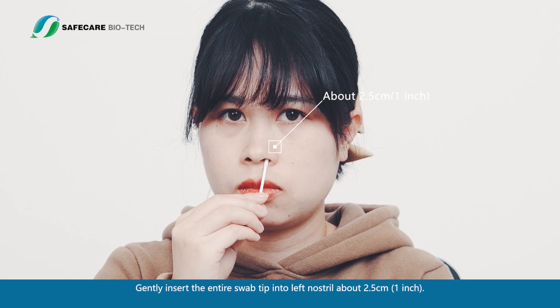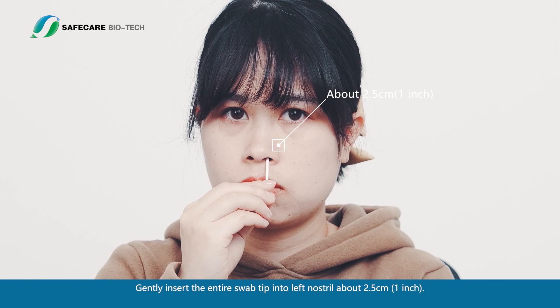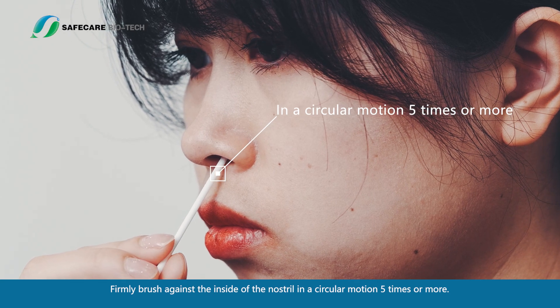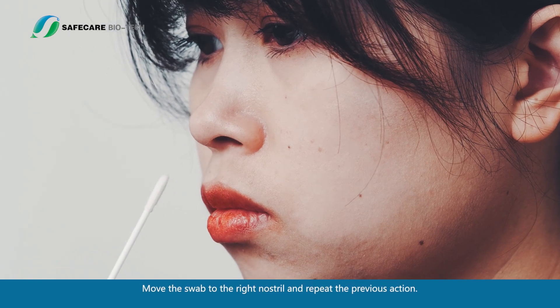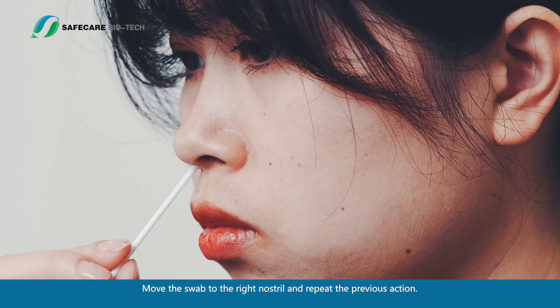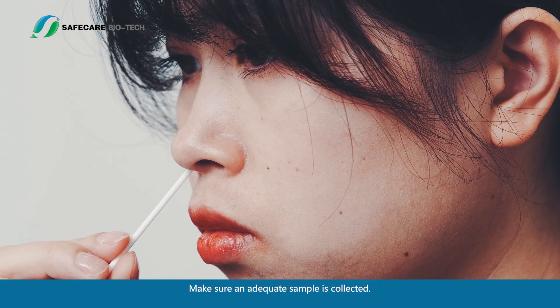Gently insert the entire swab tip into the left nostril about 2.5 cm (1 inch). Firmly brush against the inside of the nostril in a circular motion 5 times or more. Move the swab to the right nostril and repeat the previous action. Make sure an adequate sample is collected.